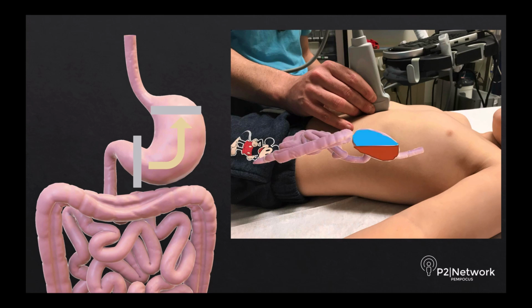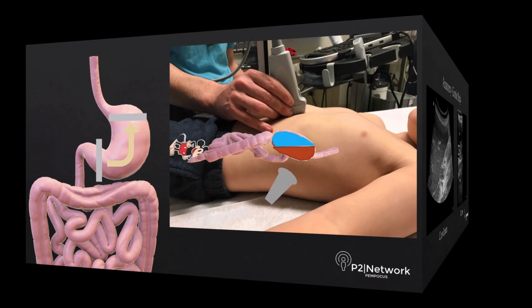Again, showing our gastric content in this position, it's going to be flattened out, and if there's air, it'll be towards the least dependent part of the stomach. And if you come in with your FAST approach and aim anterior, you may very well be able to look at that gastric content from the inferior portion and look behind the air that is otherwise being shrouded when you look from the anterior approach.